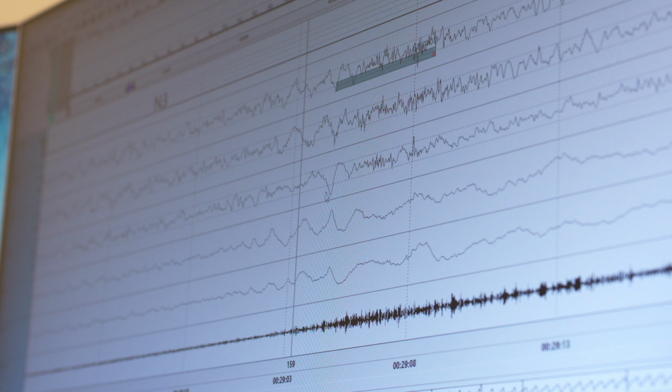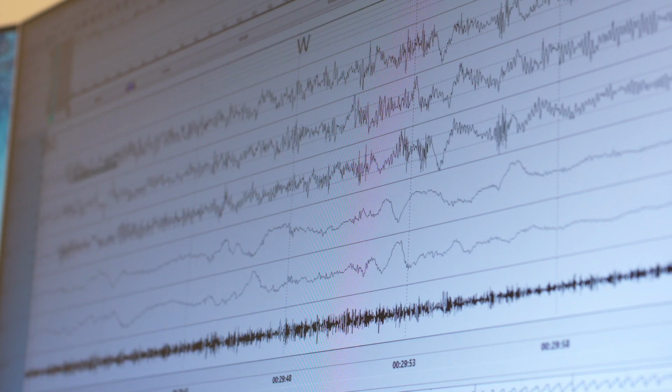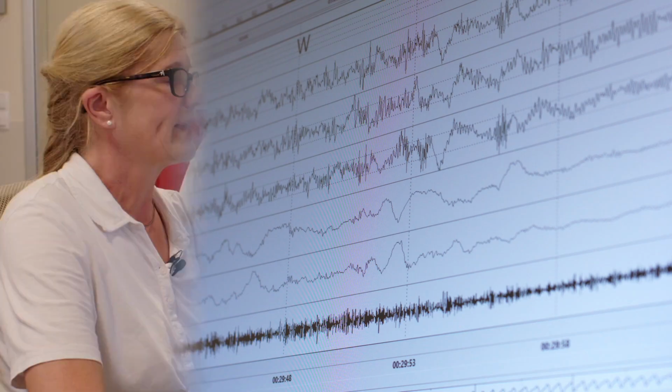But now he's awake. Something woke him up. Because it's normal for there to be a short waking phase after such a deep sleep phase. Exactly. We are back in sleep stage 1. We're seeing a small wake-up call here again. We're waiting for our grapho elements again. Here's a K complex. And now we can, that's not right, 2.